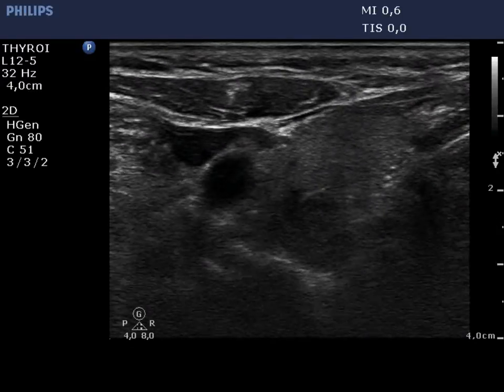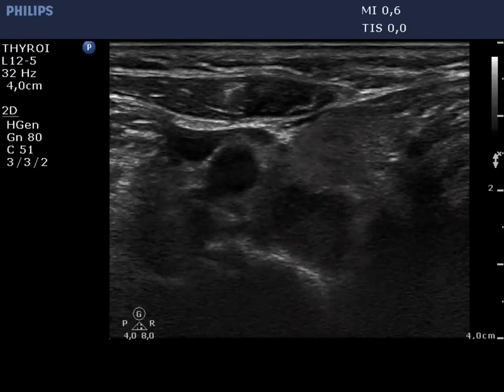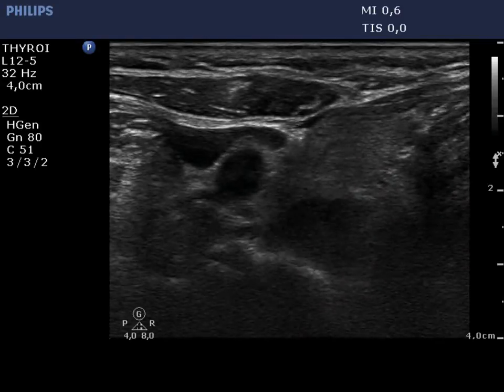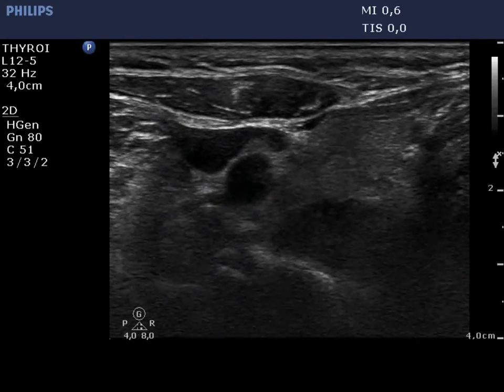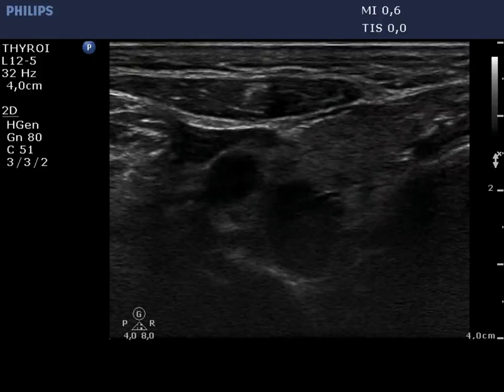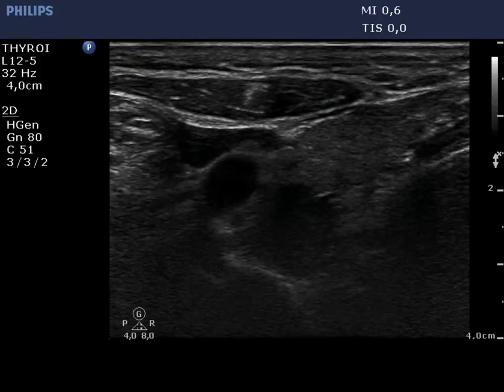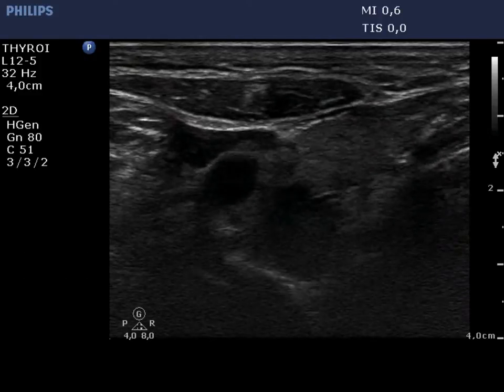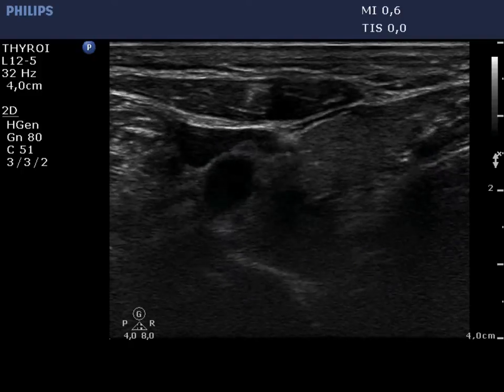Two ultrasound-guided aspirations are presented. On both occasions, only the movement of the needle can be seen, which cannot be considered as an absolute proof of successful targeting.